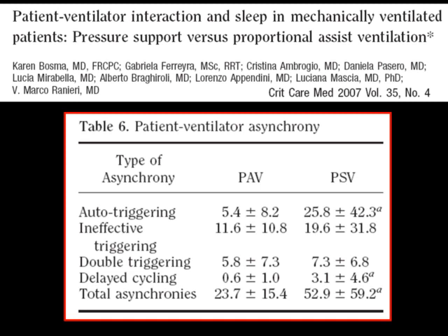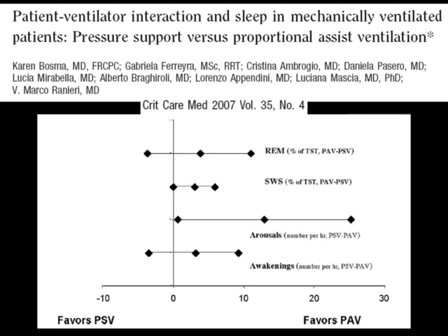Another important aspect associated with the risks connected with patient-ventilator asynchrony is the deprivation of sleep. In this nice study, patients were evaluated during sleep when receiving PAV and pressure support, and it was quite impressive to observe first that with PAV the patients reduced, halved as a matter of fact, the rate of total asynchronies, had much less arousals and awakenings, and tended to have an increase in REM sleep, suggesting that when we work on the resynchronization in patients with high asynchrony index, probably we make our patients sleep better.